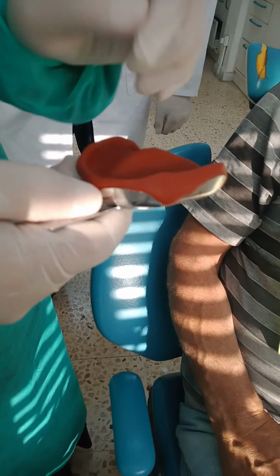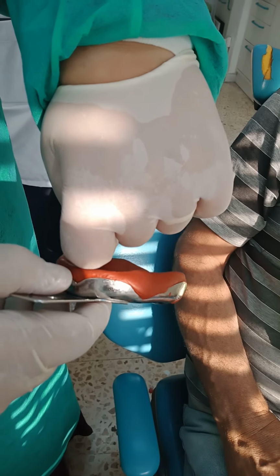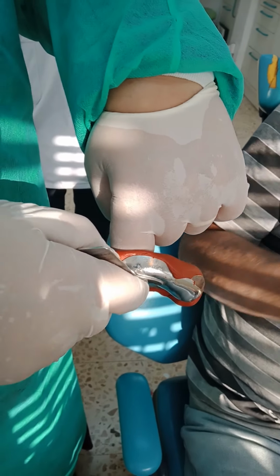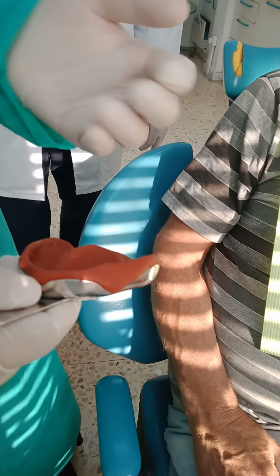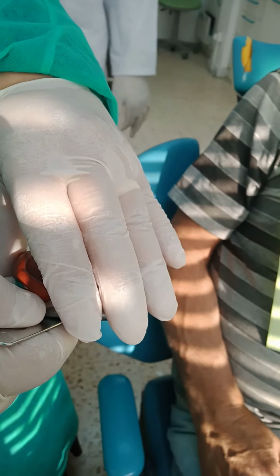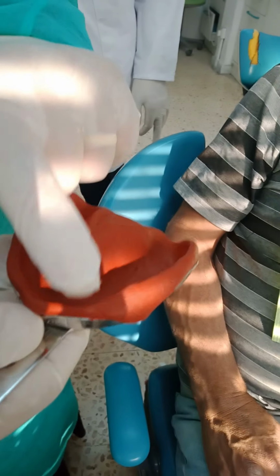To take the sulcus correctly, if I have the ridge here, I should go in front of the ridge around 1 centimeter. While I'm rotating, it will come back closer to the ridge. But by rotating closer, you will have sufficient material to go into the sulcus, and you will not have this hit. So you see this is shallow. The anatomy is telling me the impression is incorrect.